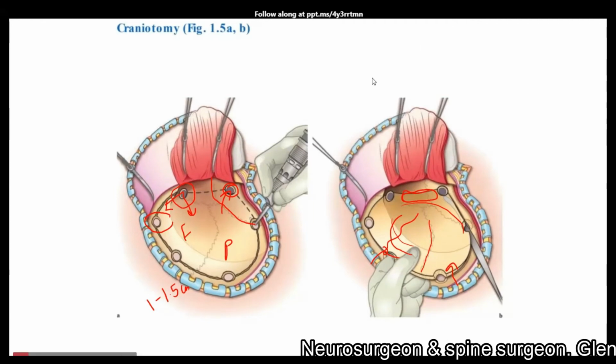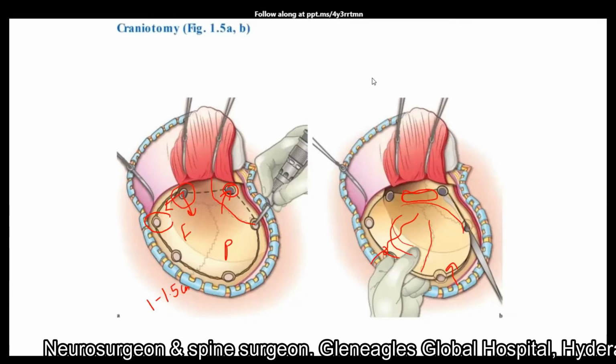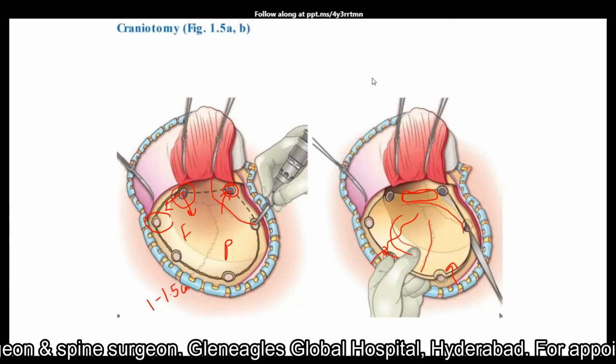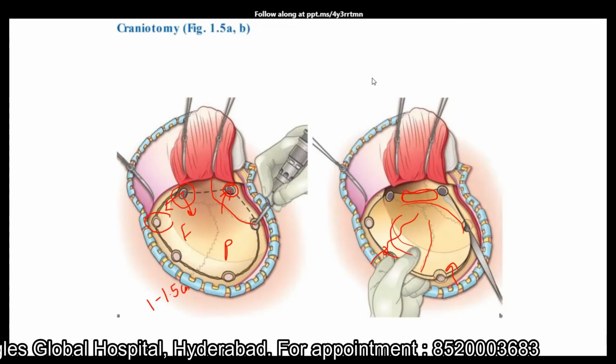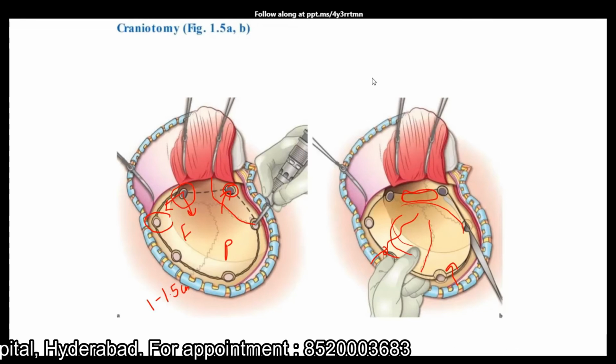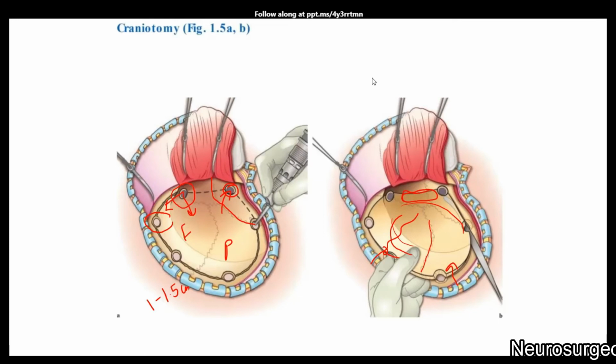Yeah, it's recording. There is always a risk that the fracture line can extend along the skull base into the foramen ovale or the foramen spinosum, causing injury to the middle meningeal artery and torrential bleeding. So we are completing elevating the bone flap. At this point, the bone flap is placed aside, soaked in antibiotic solution.